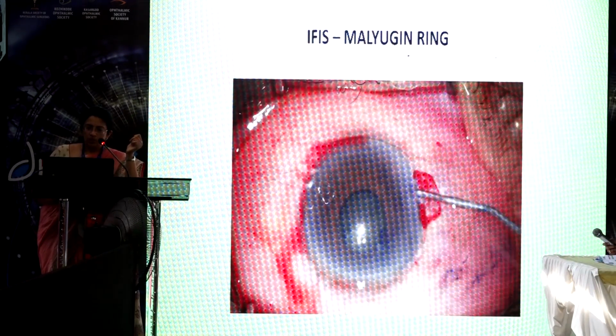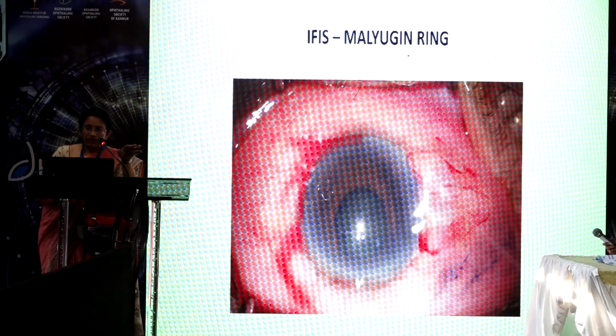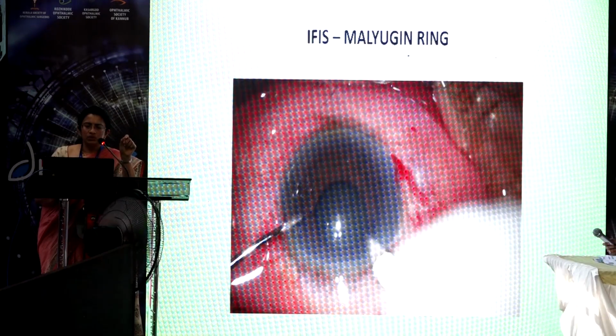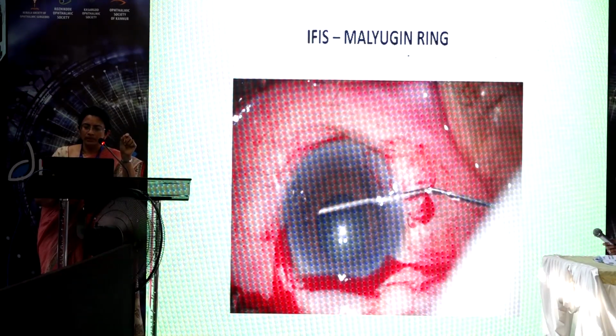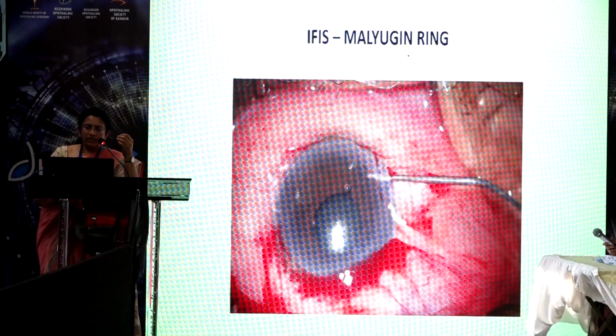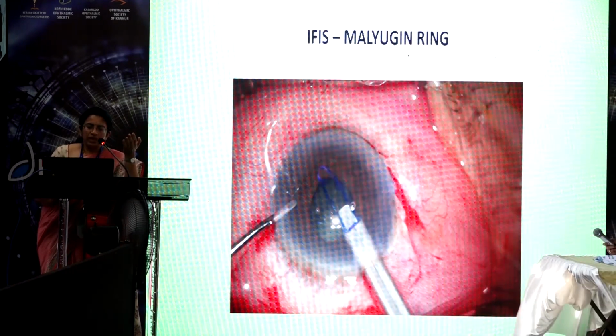So then dispersive OVD is going in, and then I don't overinflate the chamber, and the side port should have a long intracorneal tunnel, and here the clear cornea incision is also having a long intracorneal tunnel so that it prevents the iris prolapse. Now I inject little gel under the iris so that I can place the ring easily, so it gets lifted up from the anterior capsule.